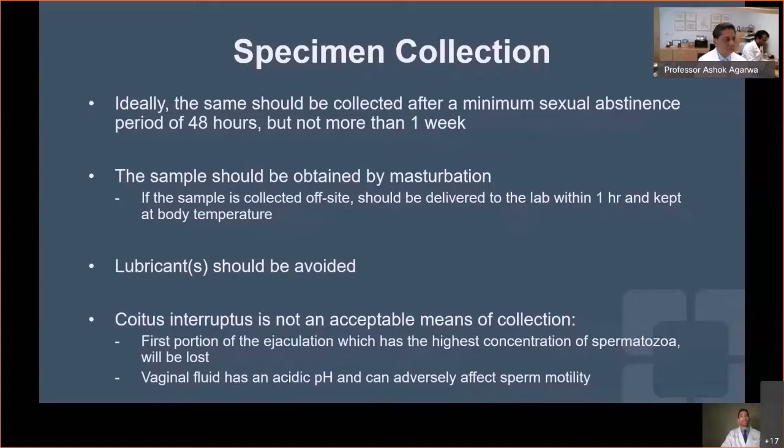Next, the sample should be obtained via masturbation. If the sample is collected off-site, the patient should deliver it to the lab within 30 minutes to 1 hour, and it should be kept at body temperature during transport. Patients should be counseled to avoid lubricants during the process, as they can be spermaticidal.